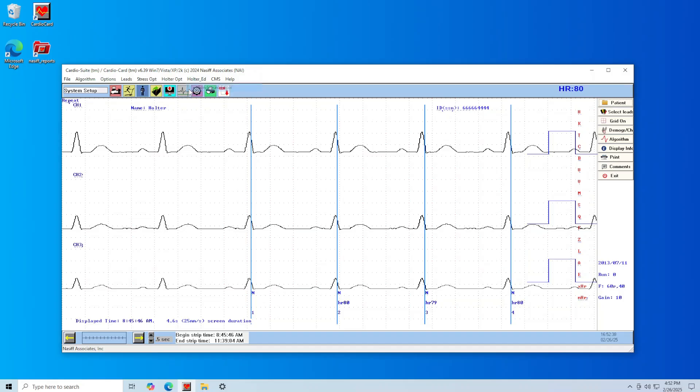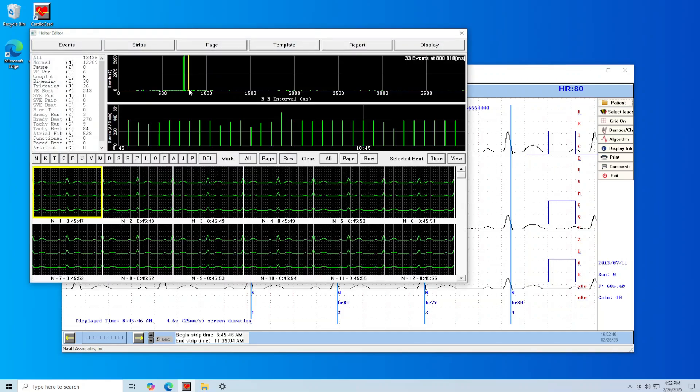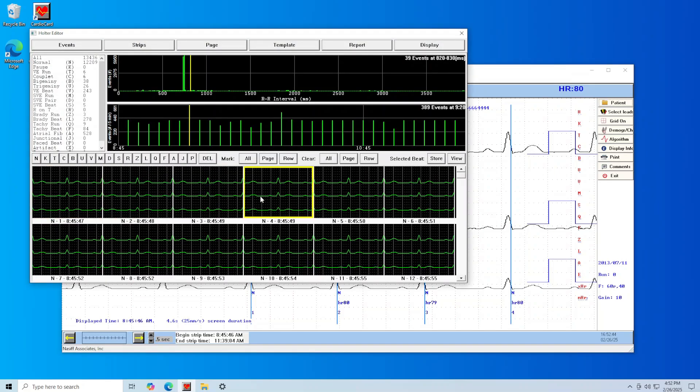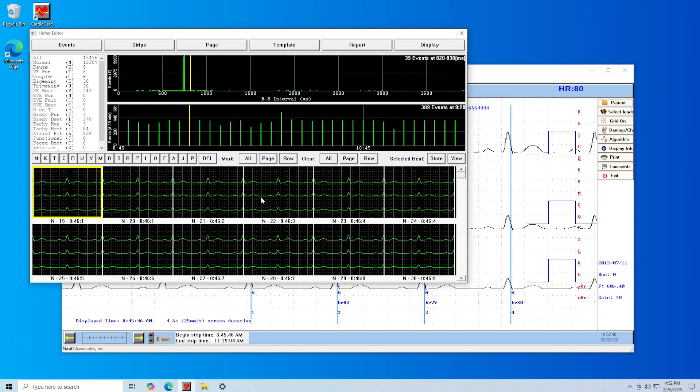From this screen you can view each section of your Holter test as well as view and select event types.